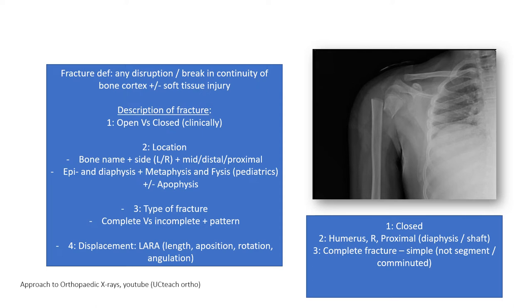And then whether or not it's displaced. And here, well, this is one of these. So L, is it shortened? Yes, it is shortened. Is it displaced or translated or appositioned? Yes, it is. It's apposition because this cortex doesn't align at all with this cortex, and it's more than the entirety of the bone, so it's more than 100%. It's 100% displaced or translated to the lateral part.